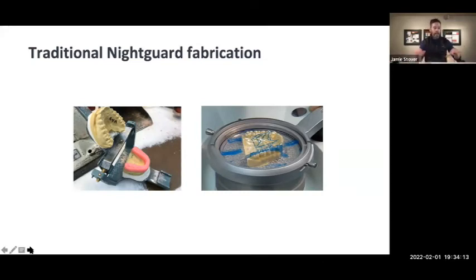If you were to take 2 prescriptions in 2 different case pans and give them to 2 different technicians in that lab and say, I would like you to do a 3D printed night guard, and I would like you to do a traditional acrylic night guard, the traditional acrylic night guard pan would come back to you to be billed out and sent to the clinician's office in a little over 4 hours. How long do you think it would take that other case pan to get back to you? Any guesses? It'd be a little over 2 hours.